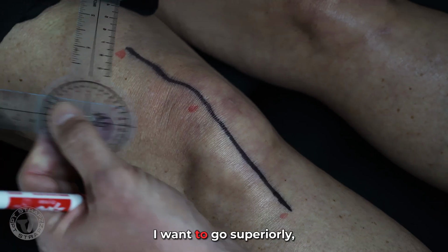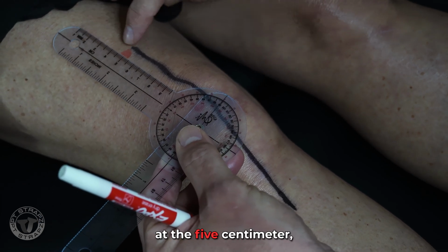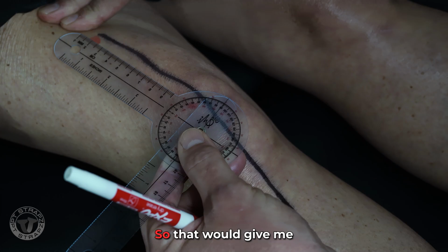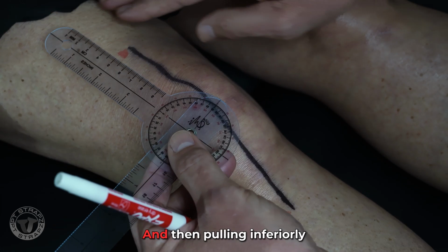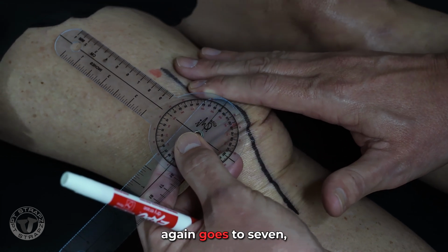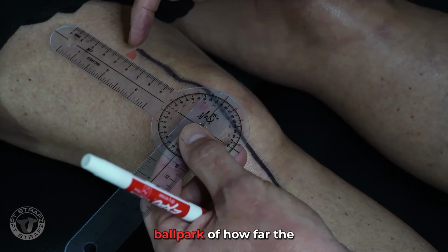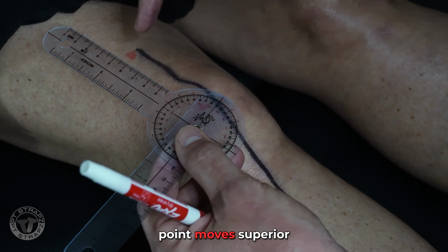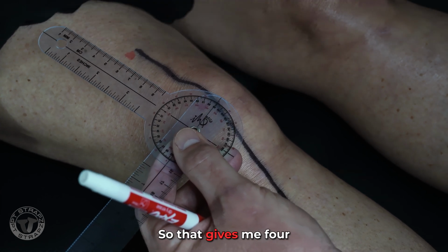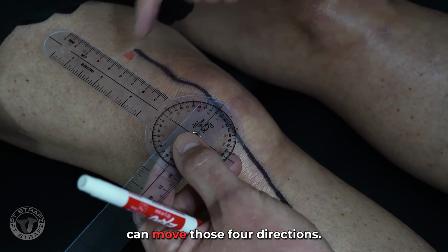And now if I want to go superiorly, I'm going to move the goni. So now starting at the 5 centimeter, I'm going to pull it up. You see it goes all the way to 2. So that would give me 3 centimeters. And then pulling inferiorly, again, goes to 7, 7.5. So that gives me a good ballpark of how far the point moves: superior, medial, lateral, and inferior. That gives me 4 directions on the map of how far this point can move.